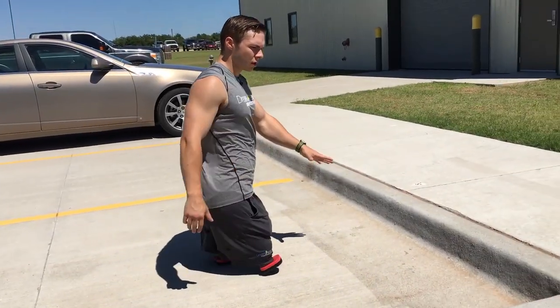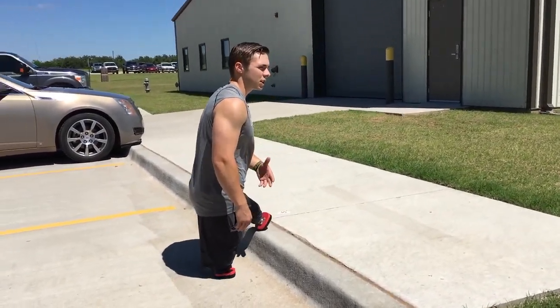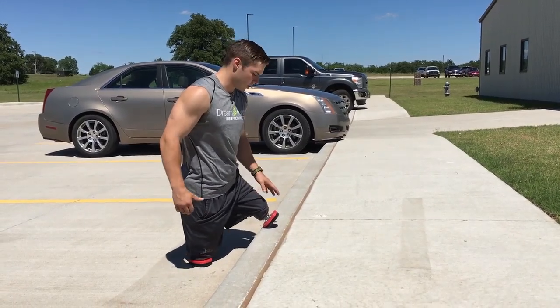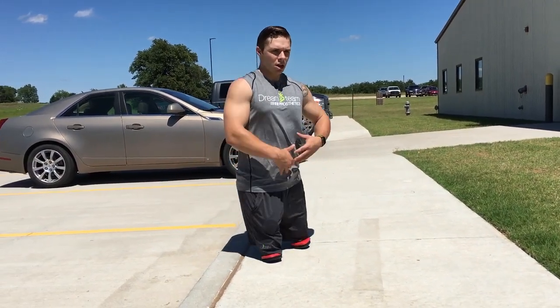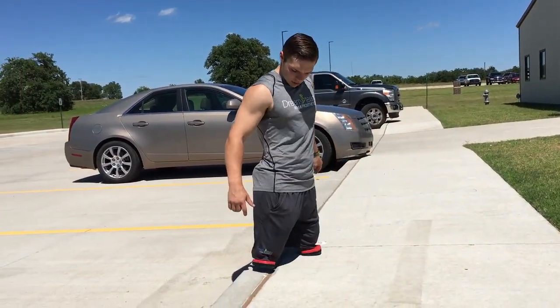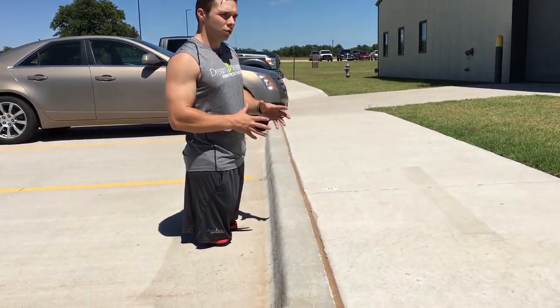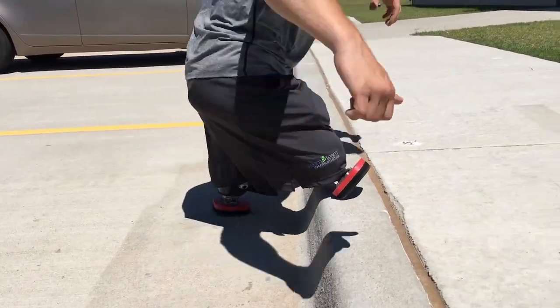This kind of goes in line with stairs because it is a step up. What this is going to teach you to do is to lean forward into the prosthesis and put all your weight into that, and really pull back with that one leg that you've got up on the step. Whenever you do that, you're building all those muscles — your hamstrings, your glutes, and even your core — that are beneficial to help pull yourself up onto the step. If you've got steps at your house, it's always good to practice because that's just helping build a better foundation for whenever you get your full-length prosthetics.